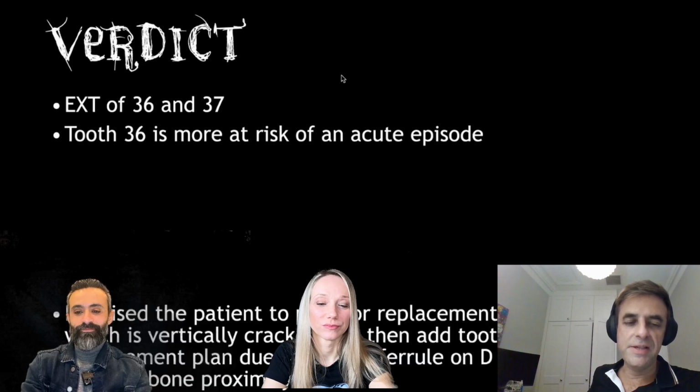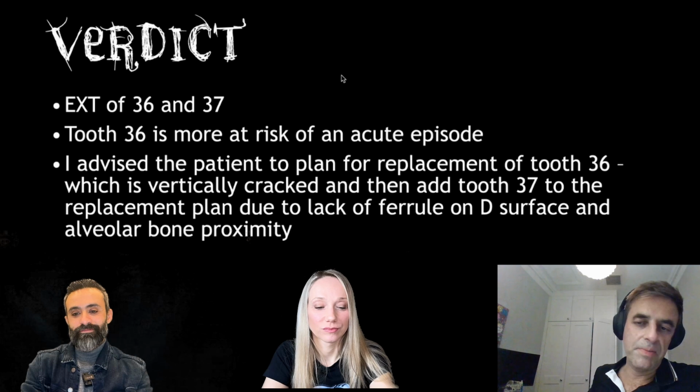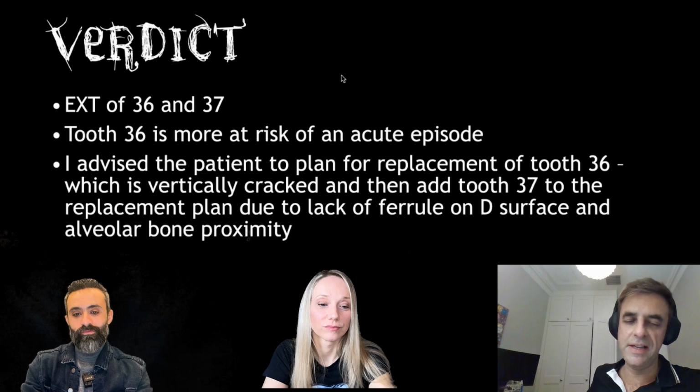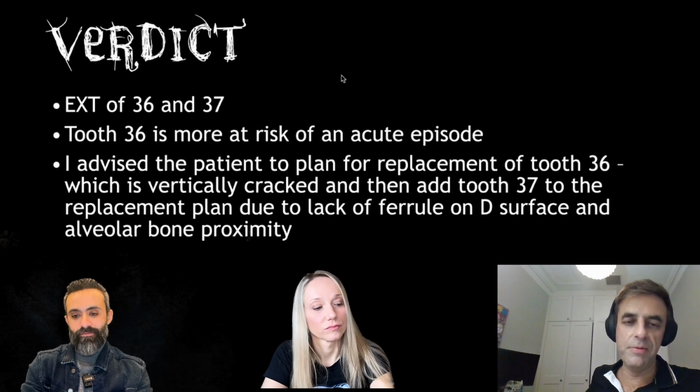Okay, so yes, as I mentioned before, the 3.6 and 3.7 extractions, but 3.6 actually has the fracture in it, and we revised replacement of 3.6 because it's fractured, and obviously 3.7 later maybe, or basically linked up with some kind of restorative plan. So it's changed our plan from treating the external cervical resorption on the second molar to extracting the first molar tooth, and just changing the plan of what was going to be done. So it really does help you with planning these cases.